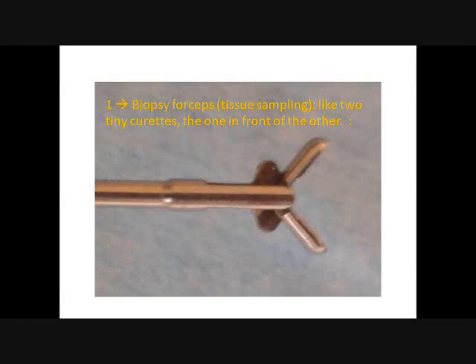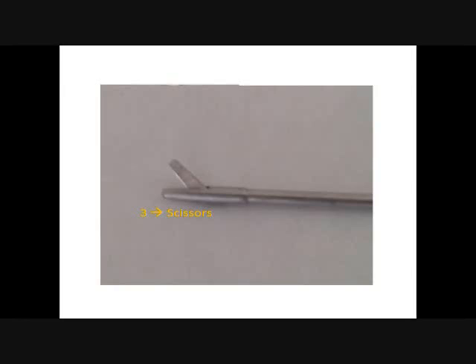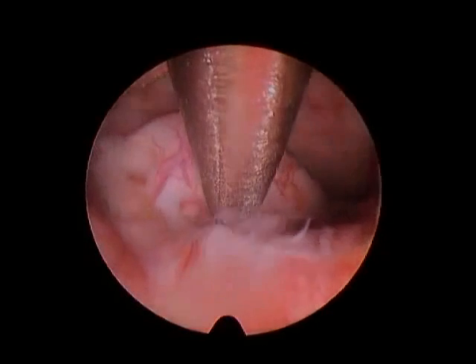It's done. Now we're going to perform a tissue sampling or a biopsy. See, we have a little growth here that we want to remove. So we take the biopsy forceps, we open it, we take the growth, and we remove both the instrument and the hysteroscope. So here's the tissue sample. Here it is, done. And last thing we're going to see is working with scissors. In this example, it's a polyp that a beginner is trying to cut. It's not perfect, true. It's a beginner's act, but we can improve with time. This is what's good about it.